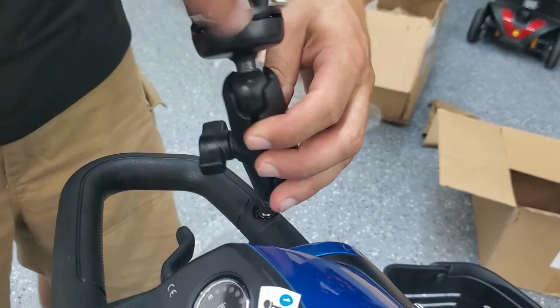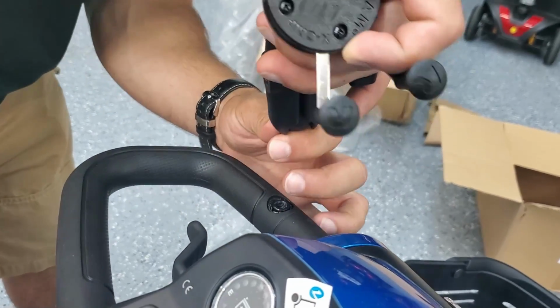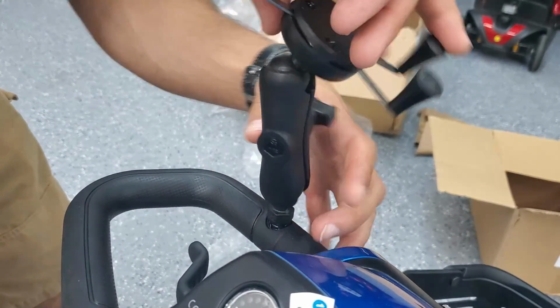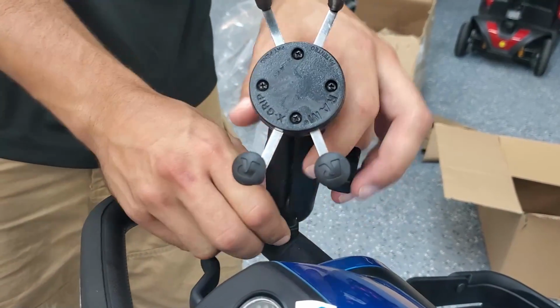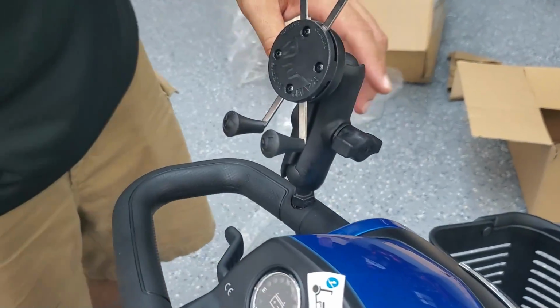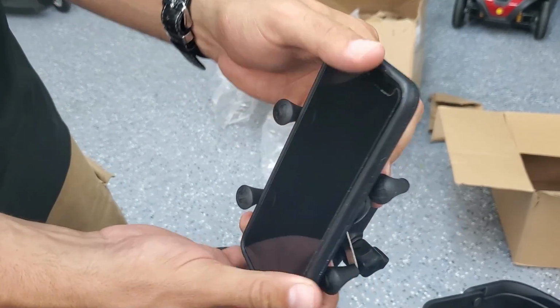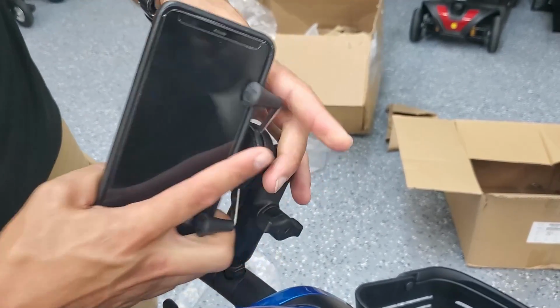And it takes a few twists to get it in there snug, and just be patient. If it takes a little while to get it. I like to straighten the bolts at the bottom and go straight on in, because otherwise you might get it in crooked and you're gonna have to start over. So just twist, twist, twist until it's tight enough. And now the top and the bottom can be adjusted. So if you want your cell phone, for example, I have a pretty big cell phone here, you kind of just get it in. And some of the phones that are bigger, you kind of have to squeeze them in, but that's how it works. So I'm going to take it out to show you.